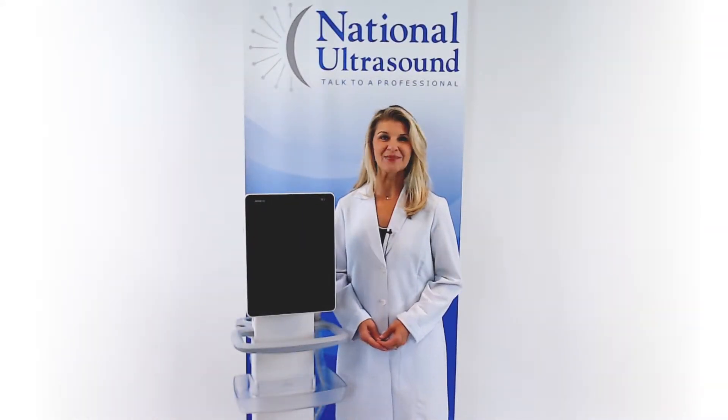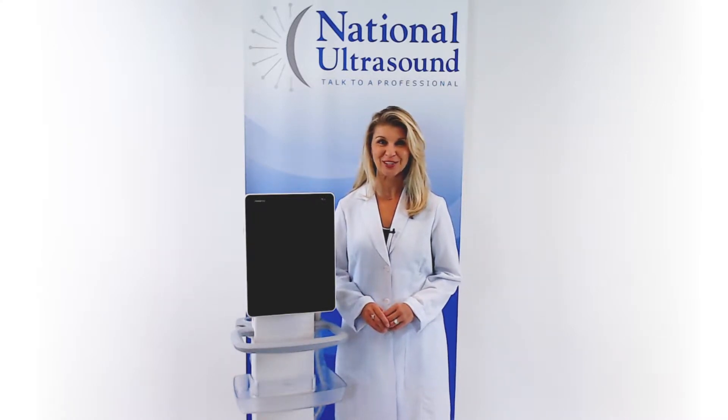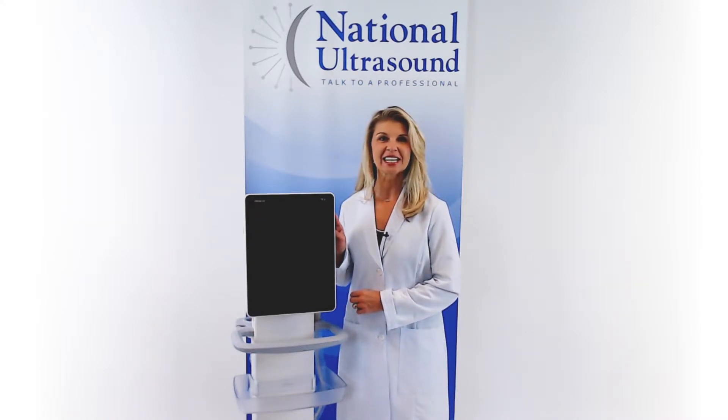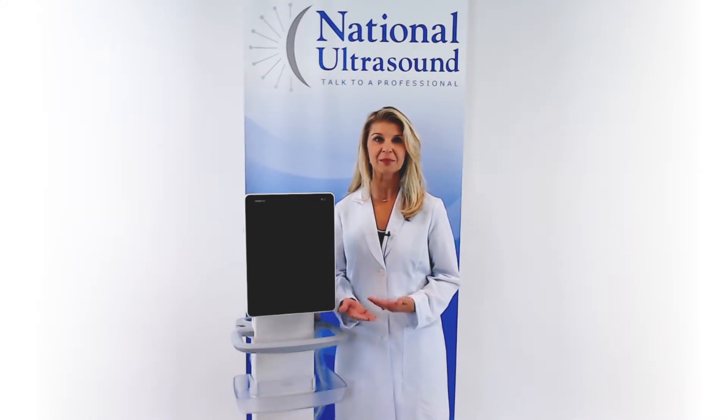Hi, my name is Brandy Benz and I have over 27 years of experience as a sonographer. Today, I am reviewing the Mindray TE5 Touchscreen Ultrasound Machine. The TE5 offers a fully-featured platform with premium image quality.